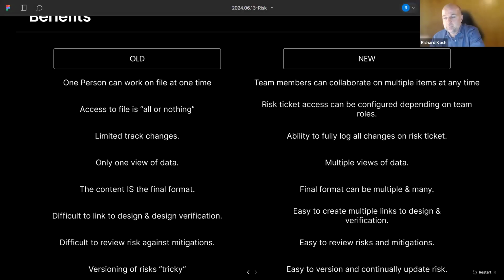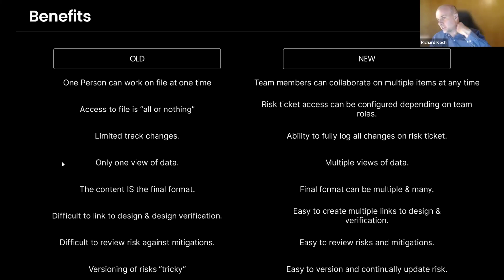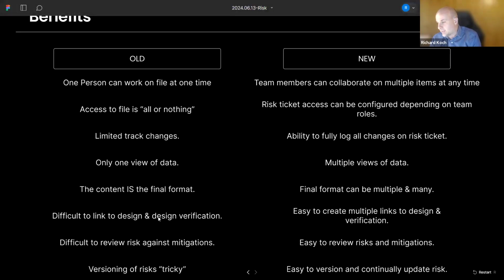Whereas if you're looking at the mitigations, then you just have a look at the first mitigations, right? The pre-mitigated risk, etc. So you really need different formats at different stages in your process. And using Jira, Confluence, etc., you can run different types of reports to address that.